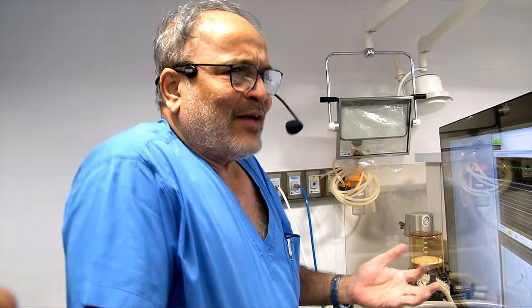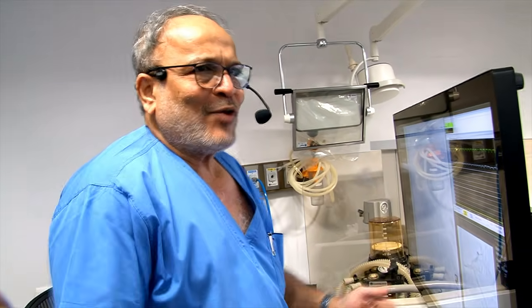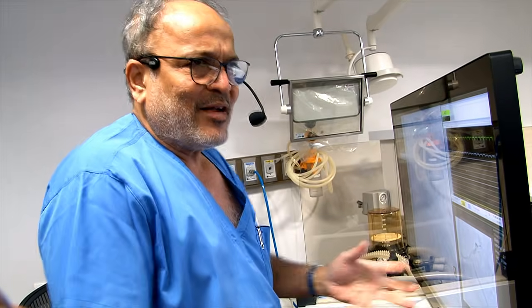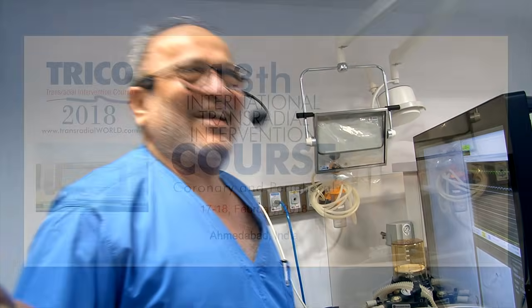Because we are the initial users, at the moment we have to work hard. We are the guinea pigs in the system, but no problem being guinea pigs for this. Thank you, sir. We are ready in the next room, sir. Thank you, sir. Yeah, sure.